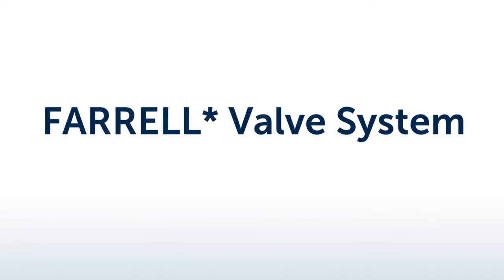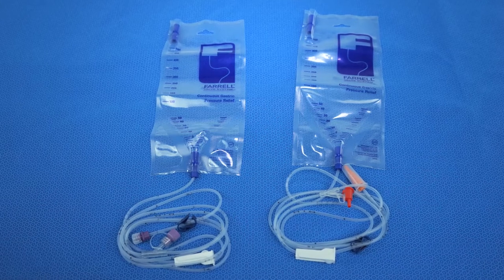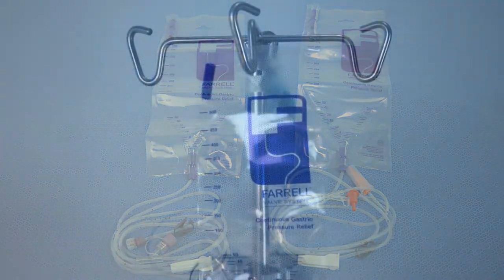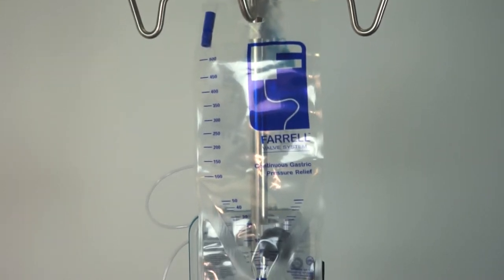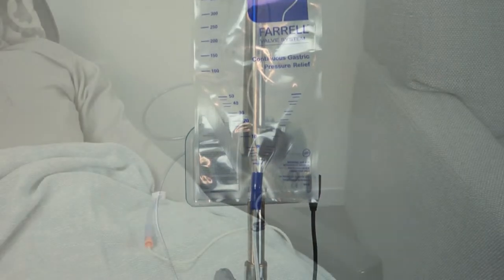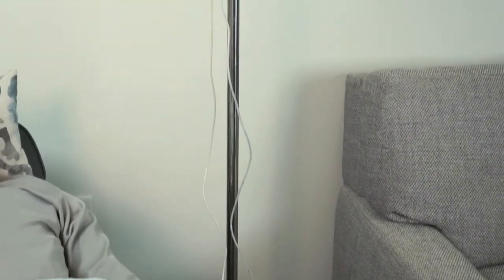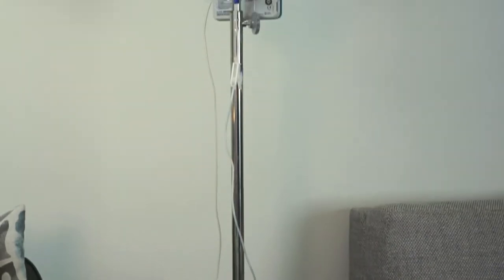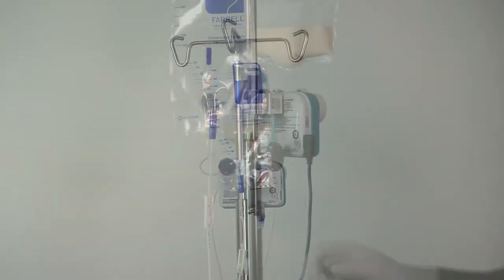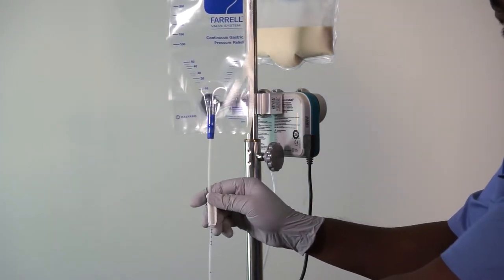The FARRELL Valve System is a closed reservoir overflow system designed to help patients who suffer from poor gastric motility, pain, and bloating. The FARRELL Valve maximizes enteral feeding by providing a channel to constantly decompress the stomach, allowing the stomach to fill at its own pace. By providing a reservoir channel, clinicians and patients can maximize enteral feeding and minimize the need for total parenteral nutrition. This video demonstrates the correct way to use the FARRELL Valve System.